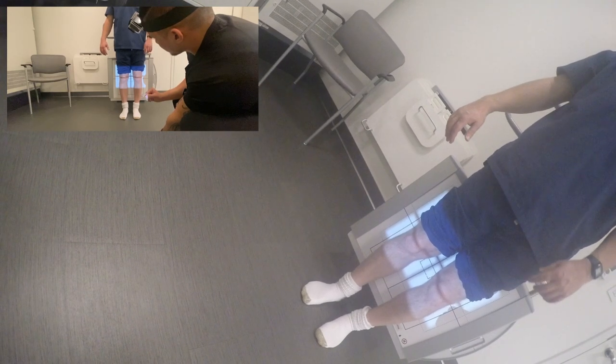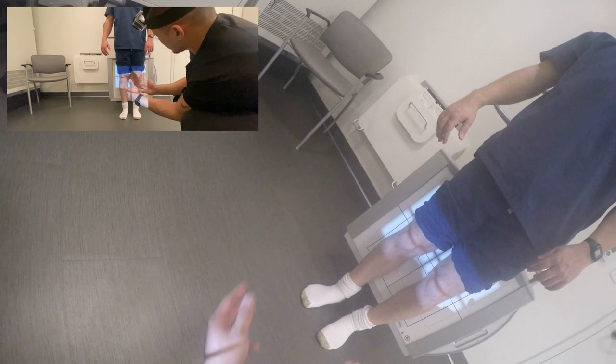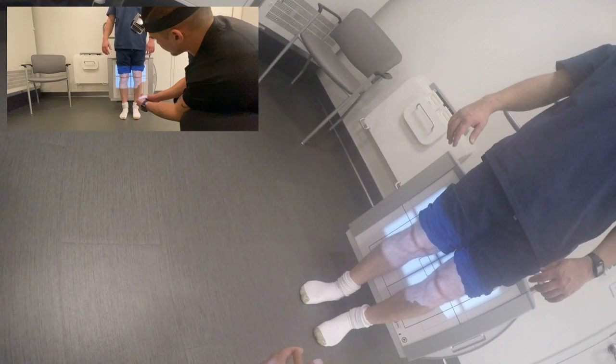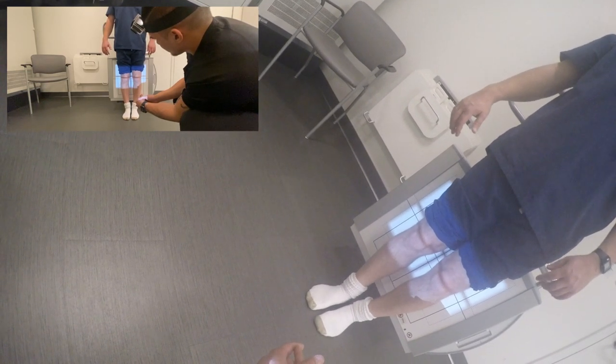AP directions are similar to PA. However, at times you may find your tube may not be able to reach that low for some patients. Looking back, I should have gotten a stool to give my patient some height to get my central ray half inch below the apex of the patella. So do better than me, alright?